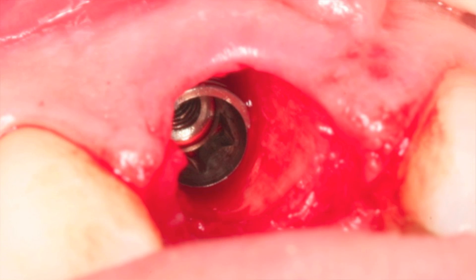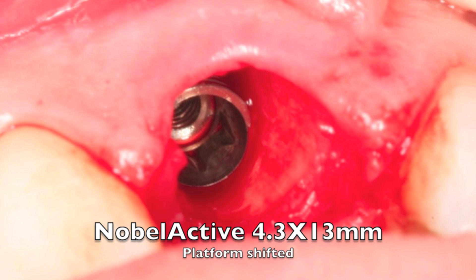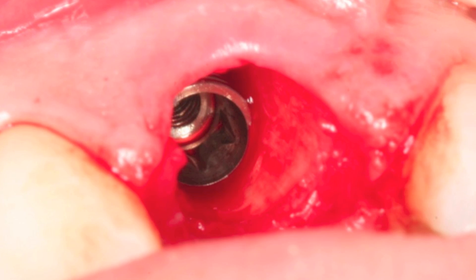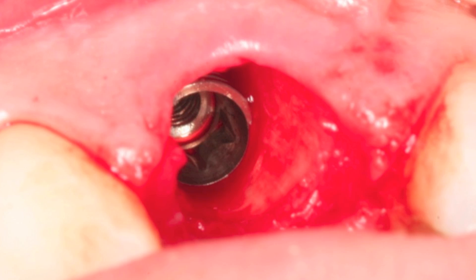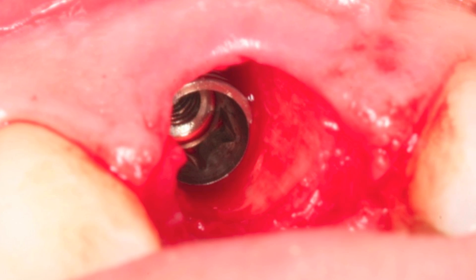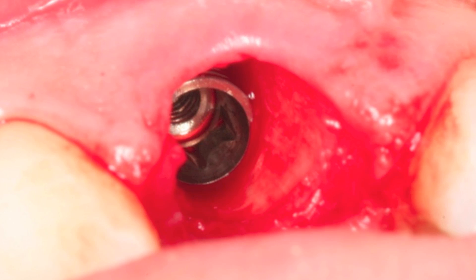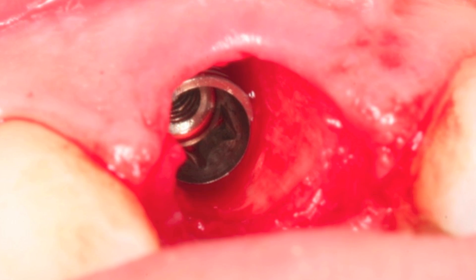The implant is placed — we can see the internal connection, the hex, the conical seal, the platform shift, and notice the bone on the lingual. It's actually rebounding over the lingual area. So this is an area that we're going to have to come back and trim to make sure that this area is going to be doing well when we place the prosthetics, because this can impede the prosthetics from seating if we're not clearing this area out.